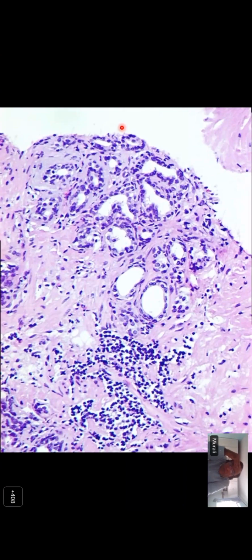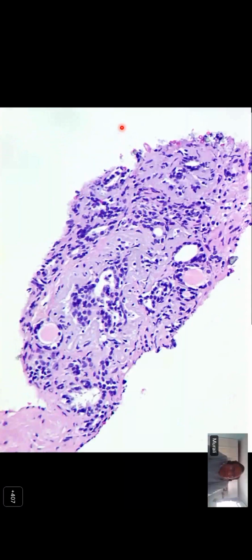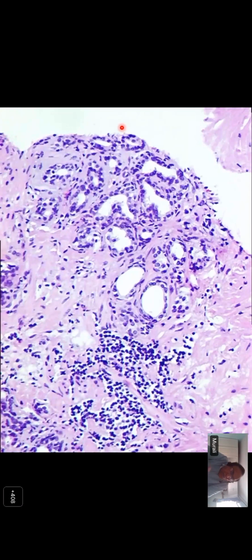So we talk about atrophy in the prostate. When you talk about atrophy or an atrophic pattern, you can get prostate cancers with an atrophic pattern. So what do we mean by atrophy? That the gland to stroma ratio is less. In the prostate, we have a very specific definition for what we mean by atrophy. Sir, there is a decrease in the lateral and apical cytoplasm.